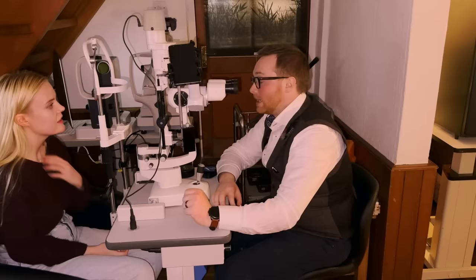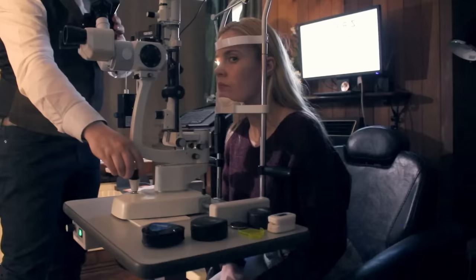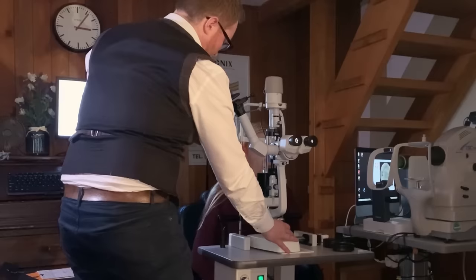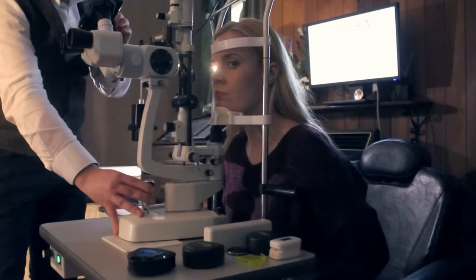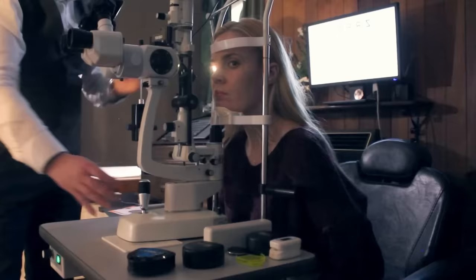So yeah, pop on for a second. What I'm going to do is just get the lighting set up for this. I'll get you to look over to your left for me, so you're not going to stare into the bright light. Excellent. And sit back. Okay.